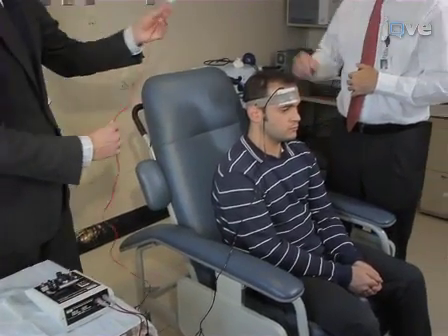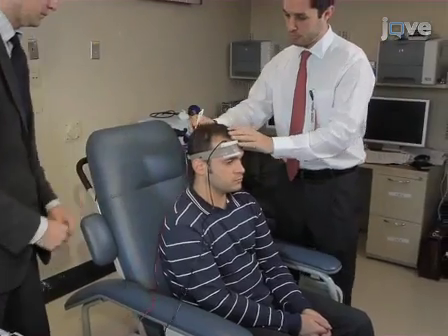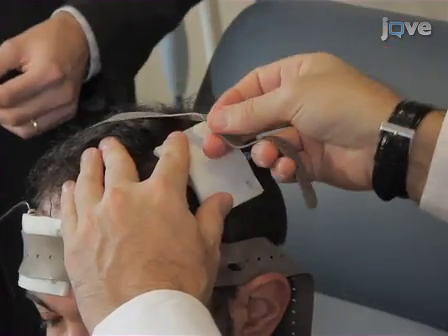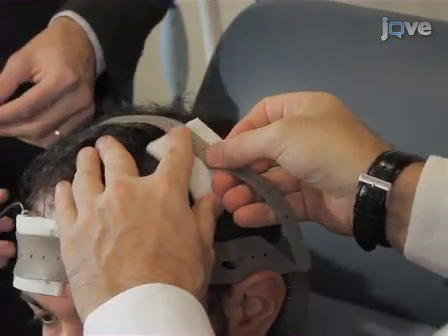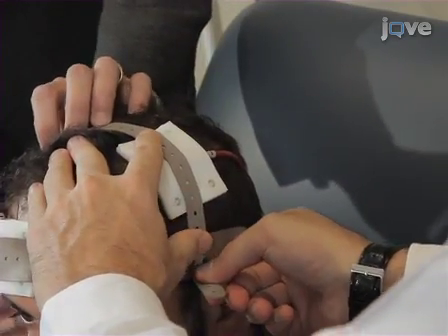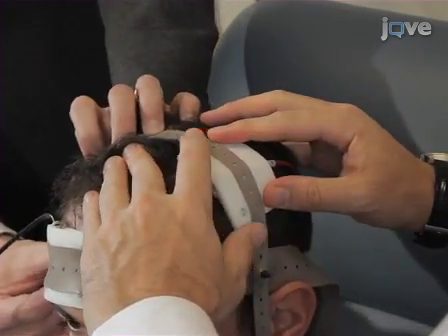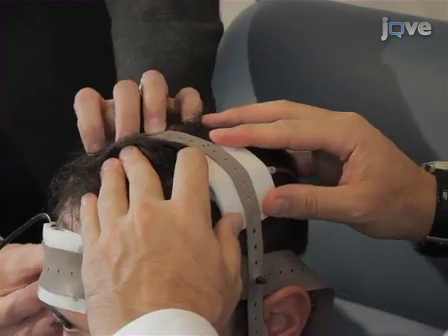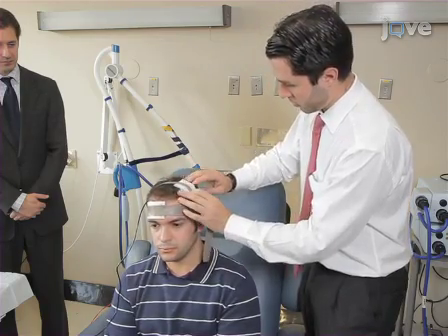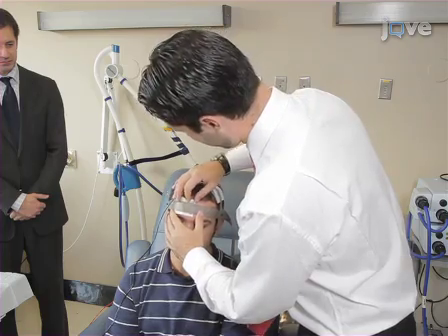Next, connect the second elastic head strap to the first one according to the desired electrode montage. Here, stimulation over primary motor cortex will be demonstrated, so the sponge holding the anodal electrode is placed under the second elastic head strap over the M1 location. Assure that the sponges are not excessively wet, but moist enough to have good electrode contact.